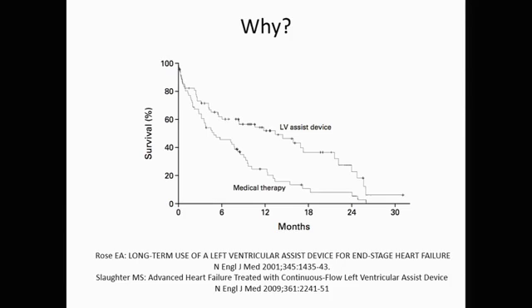Why do these devices fail after 18 months? This is a study of pulsatile devices, and the valves tended to fail at around 18 months. So between 18 and 24 months in this Kaplan-Meier curve, the reason that all those patients are dying is because their devices are failing.